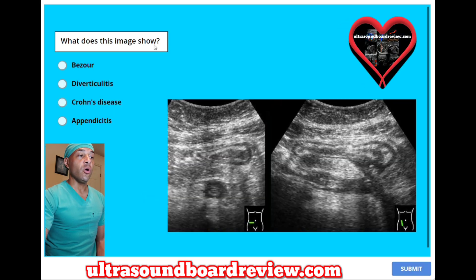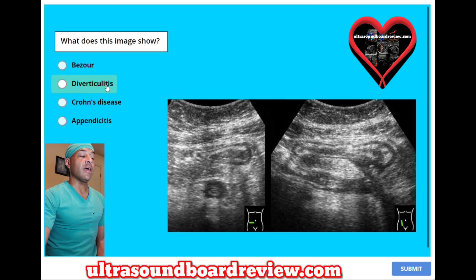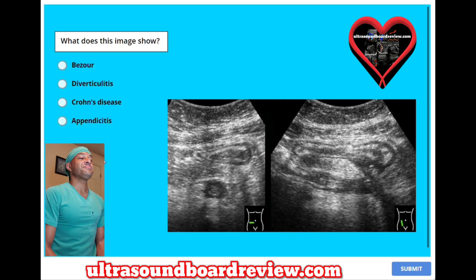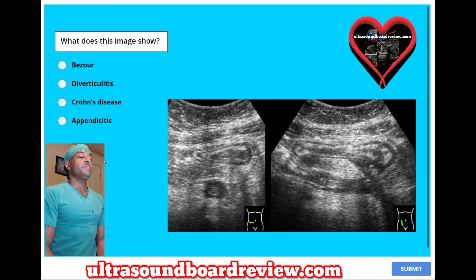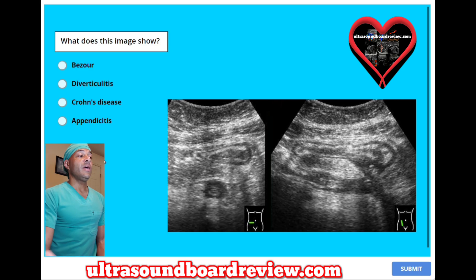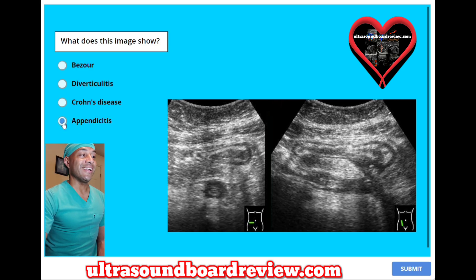What does this image show? A. Bezaur. B. Diverticulitis. C. Crohn's disease. Or D. Appendicitis. The answer is D. Appendicitis.